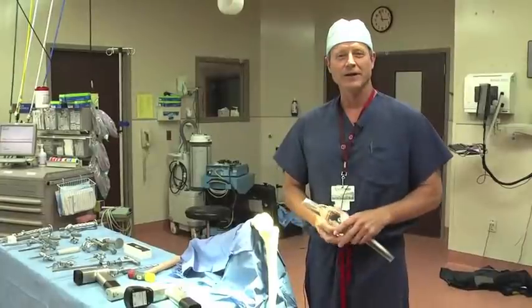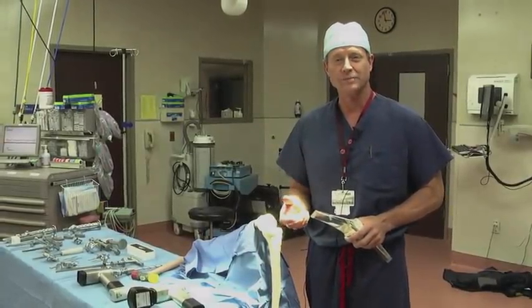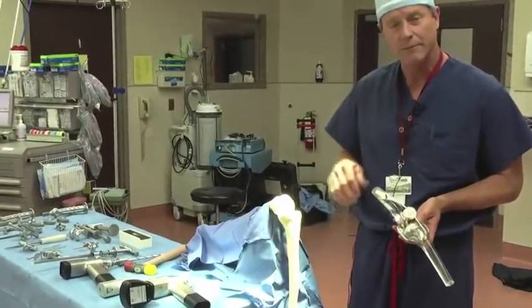Hey, I'm Dr. Eric Janssen, and today we're going to demonstrate what we call a dry bones model for total knee replacements. This is just a model of the femur, the thigh bone, and the tibia bone down below.